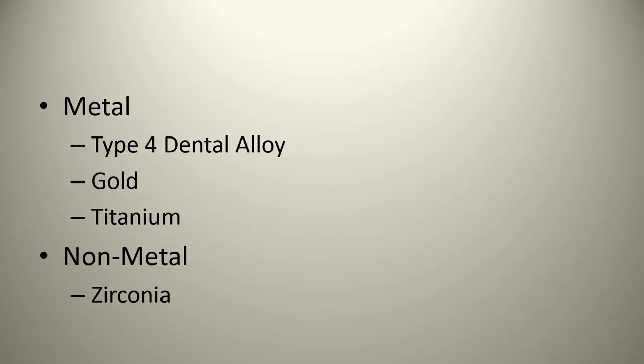There's also many non-metal options that are out there. People talk about monolithic ceramics, things like zirconia. There were, in the old days, the Procera aluminum oxide based copings. Many of these are excellent. They have got excellent strength, or static strength.